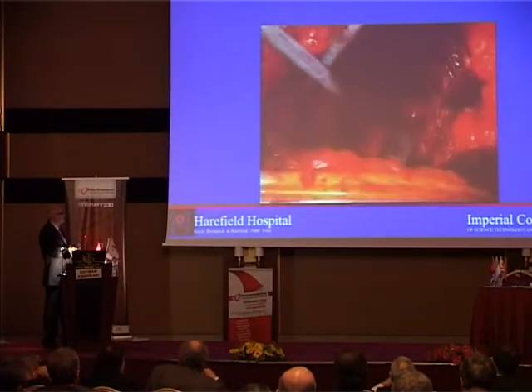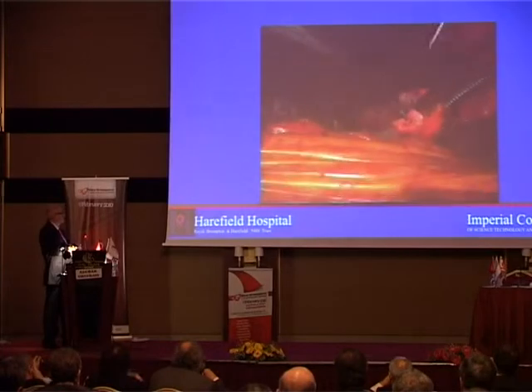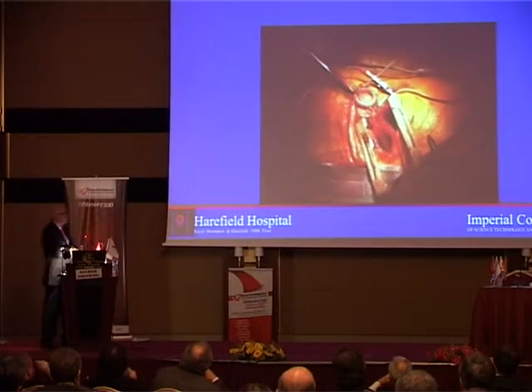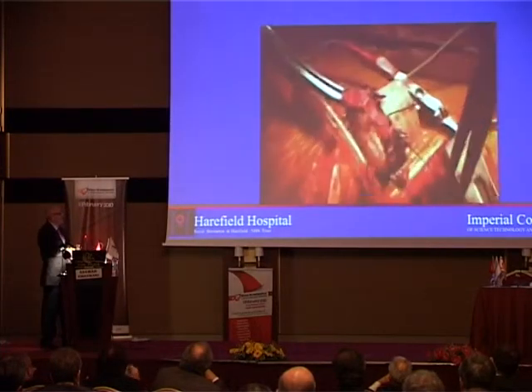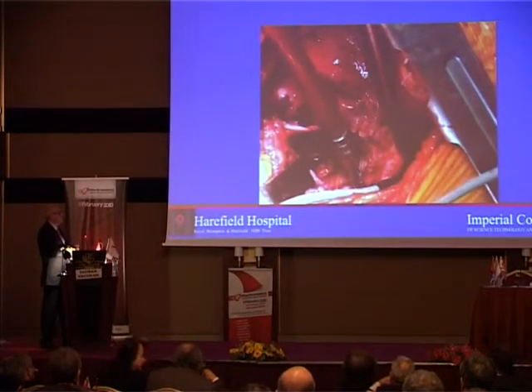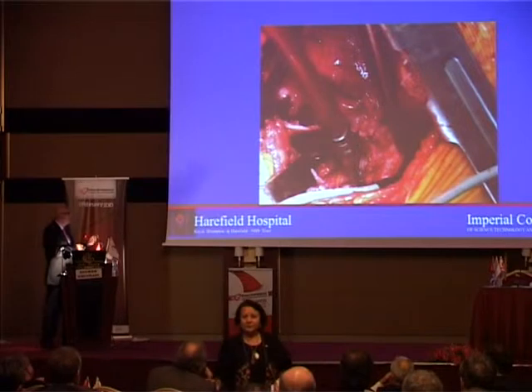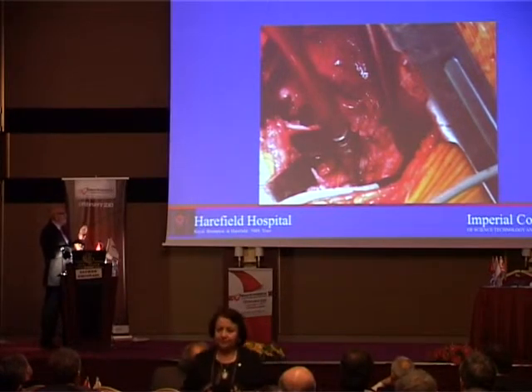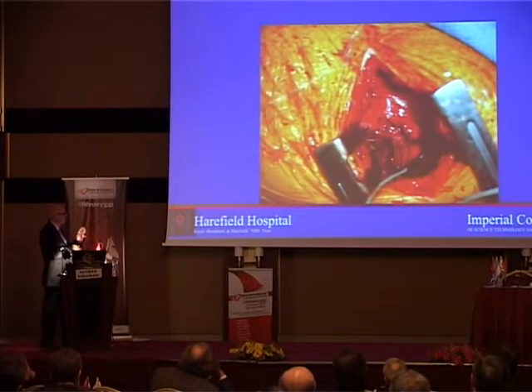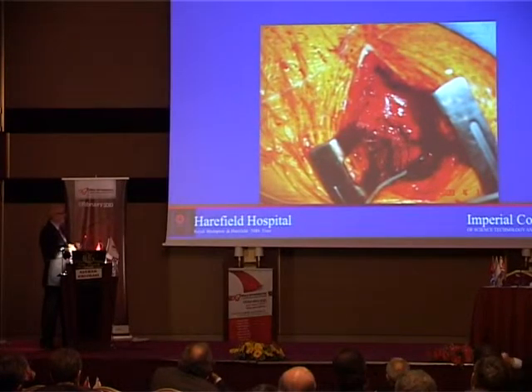The cuff has come out. Some people worry about closing the apex of the heart after removing this cuff, but it is actually quite tough tissue because of fibrosis around that. We just use a continuous suture and close the apex of the heart. And there's no problem. Obviously, you have to inspect for presence of clot around that, and you have a very good vision of that actually. You can see through the hole, you can see inside the ventricle. After clearing any debris around that, you can just directly close that apex.